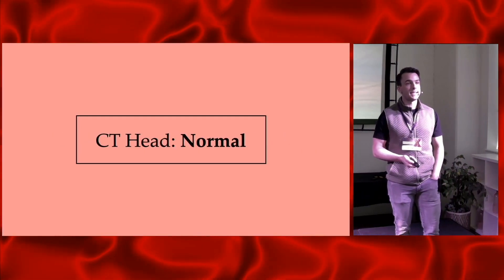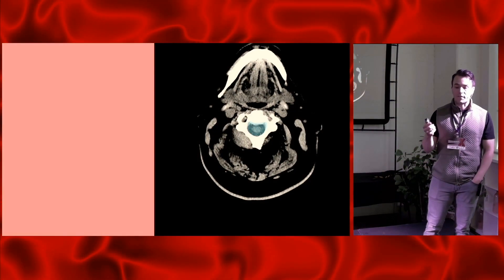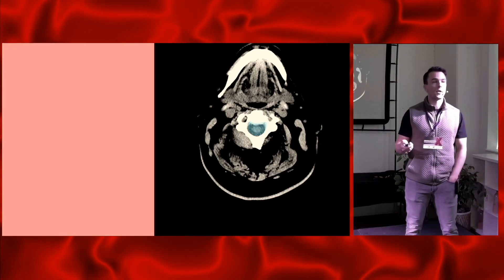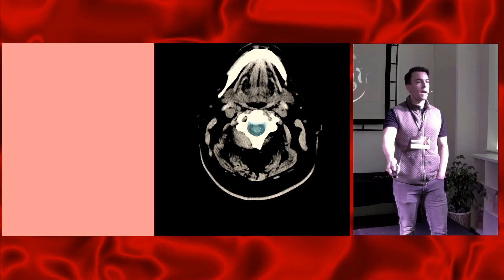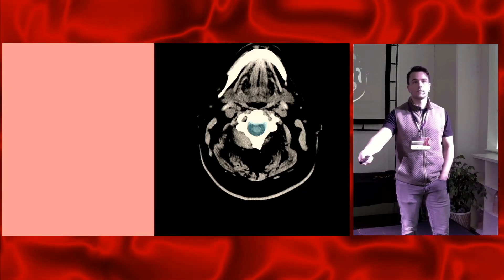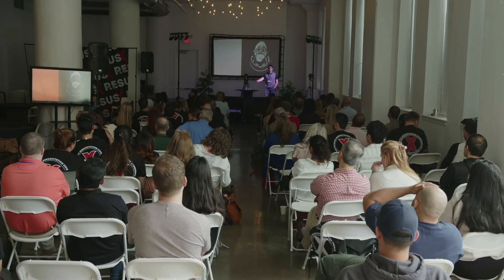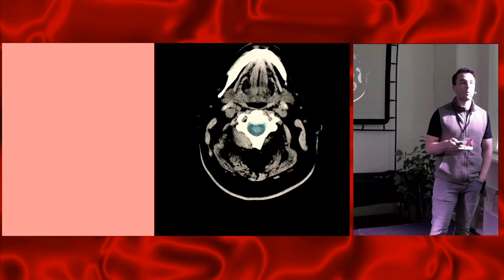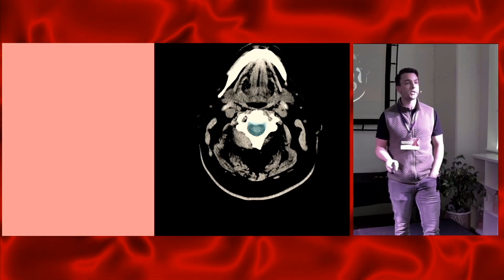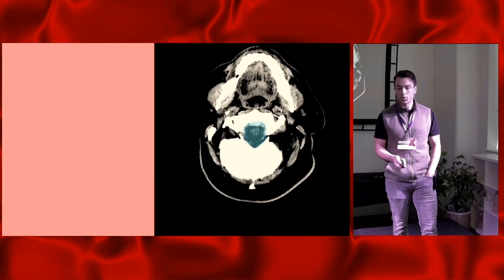Going through a normal CT head, highlighted in blue is where you focus in the quadrant approach. We're starting at the foramen magnum — where the brain stem sits. This is really important to start here because if a patient has a GCS of 3, you want to make sure they're not herniating into the foramen magnum.